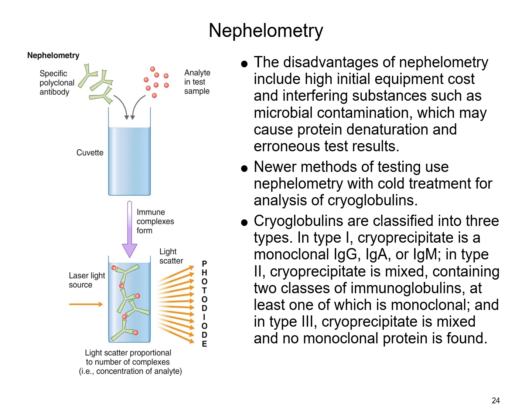There are some disadvantages to this particular test method, one being that it has a very high initial cost to set it up, and the other is that there are interfering substances like microbial contamination that can cause protein denaturing, and that's going to give you some erroneous results.